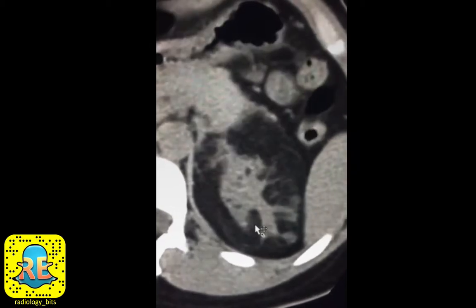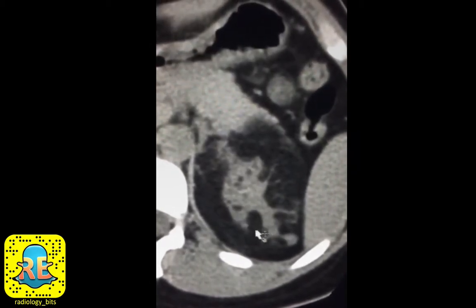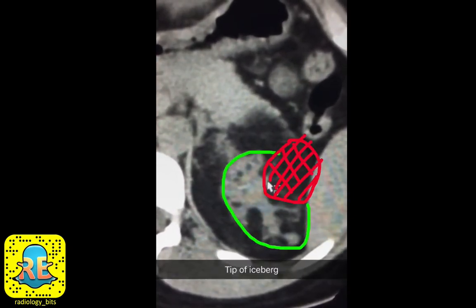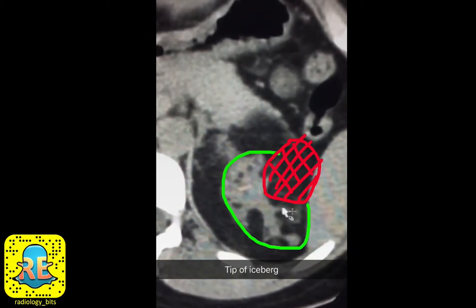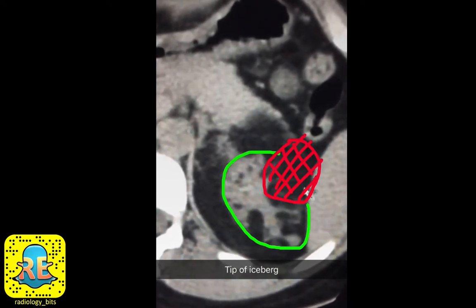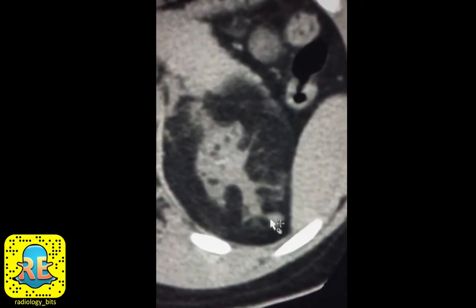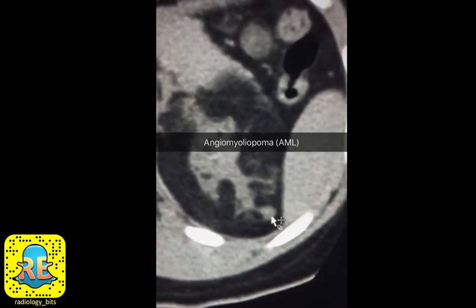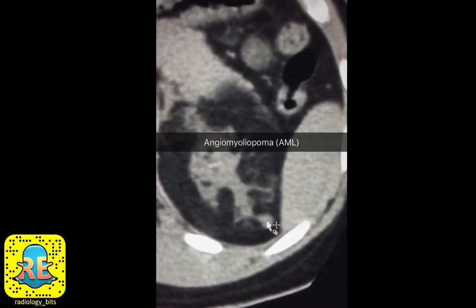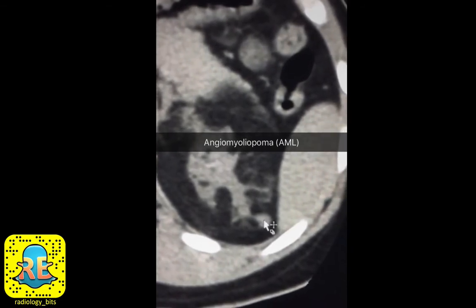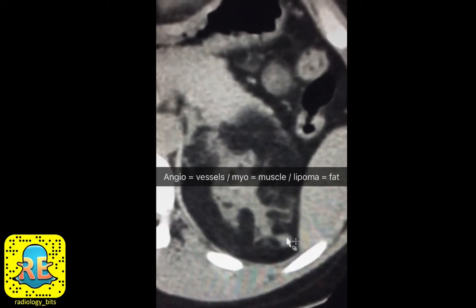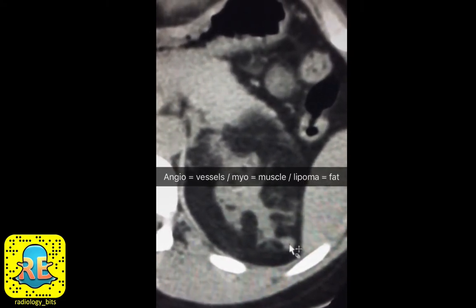That's why some authors call this the tip of the iceberg lesion — you have a small tip visible here, but the remainder of the iceberg is actually outside. The lesion we saw in the lower pole on the catheter angiogram extending outside the kidney is a good example of this. These renal lesions also have soft tissue components, likely representing smooth muscle. That's why these lesions are known as angiomyolipomas — they contain vessels (the angio part), muscles (the myo part), and fat (the lipoma part).